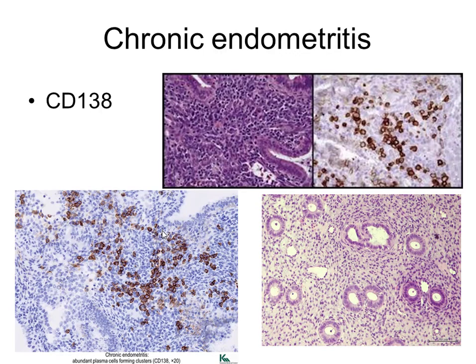Here you can see also how immunohistochemistry can help us to diagnose chronic endometritis. Chronic endometritis is a very interesting pathology which has no clinical picture except infertility.